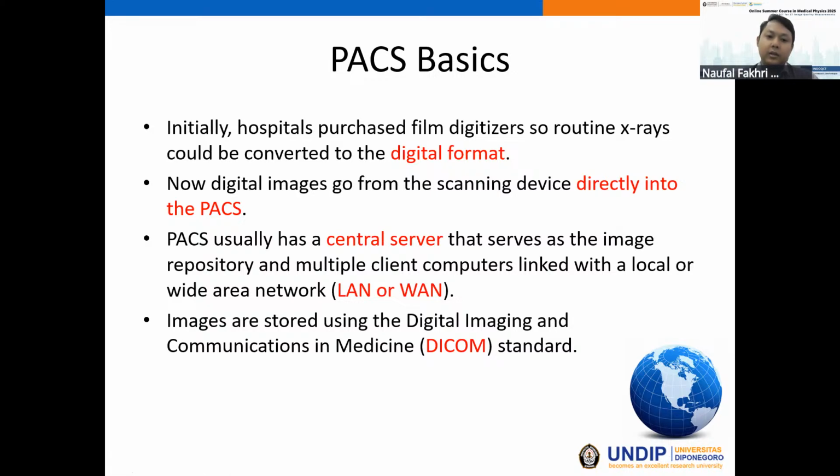Initially, before PACS, hospitals purchased film digitizers so routine X-rays would be converted to digital format. So we were converting from film to digital format. Now it is common for digital images to go from the scanning devices directly into the PACS.